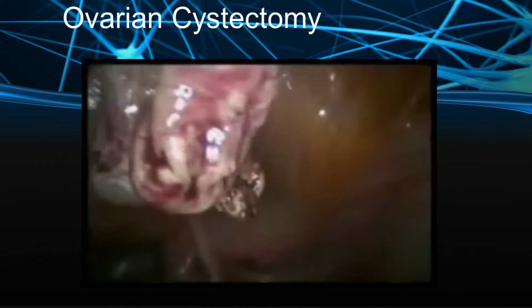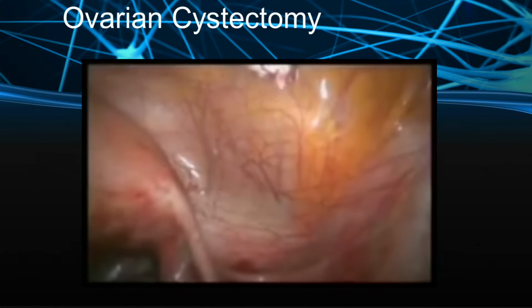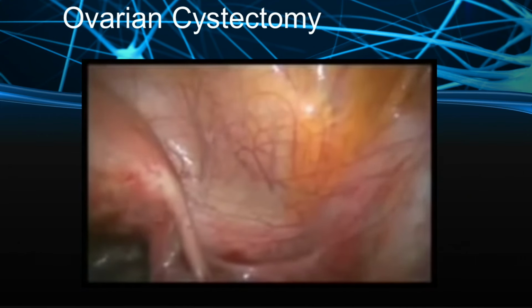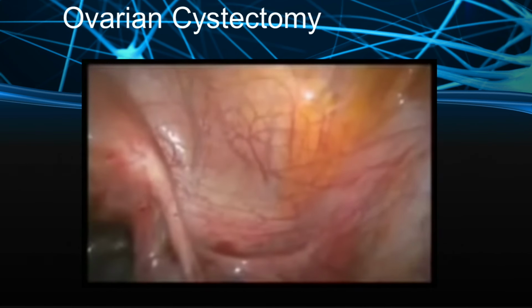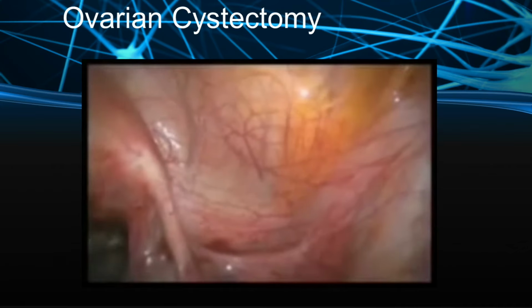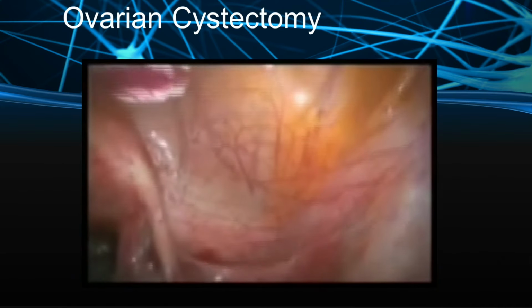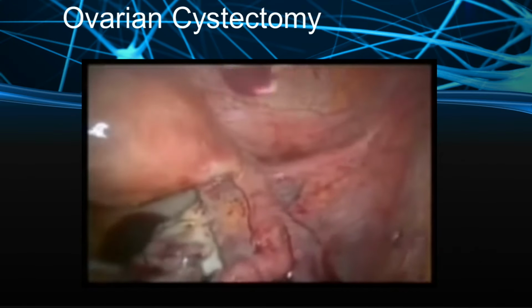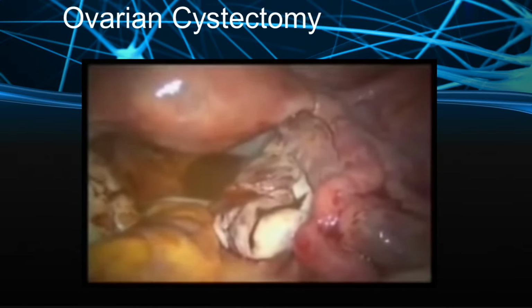Endo bag is good because that can prevent the contamination of the abdominal wall, and then you can aspirate it thoroughly. Taking it out is sometimes challenging, and if you have enlarged the incision, you must close the port because it is no more 10 millimeters. So, suture passer has to be used and close it.